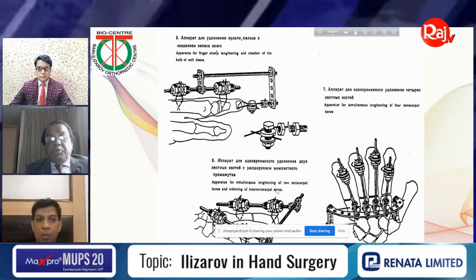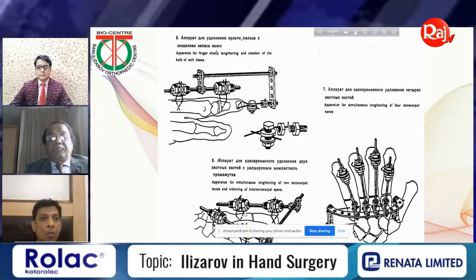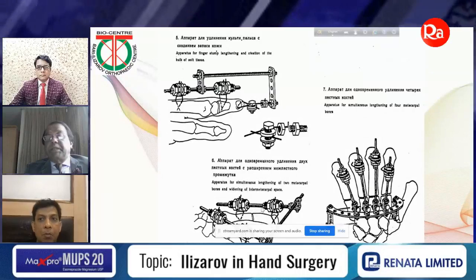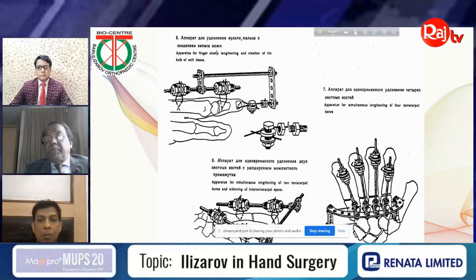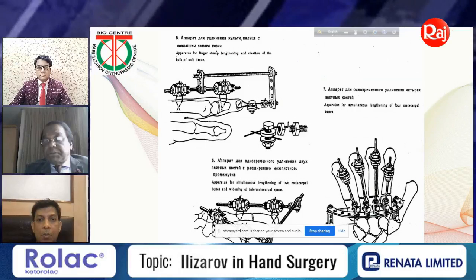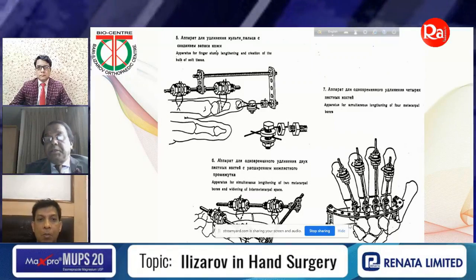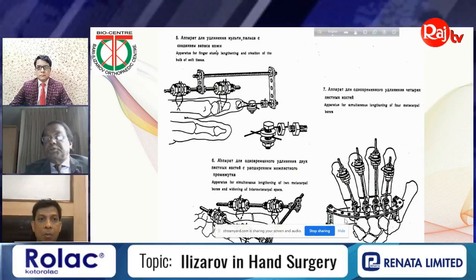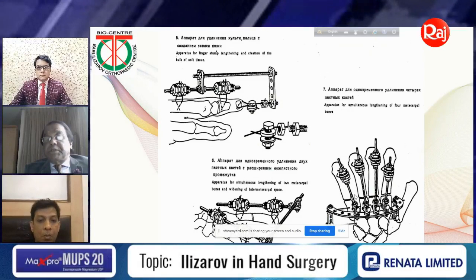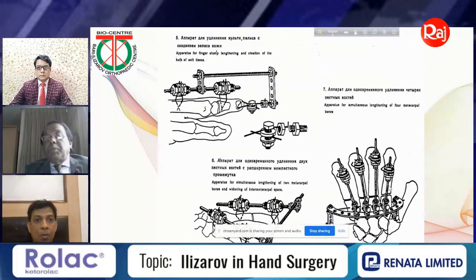Now, dear friend, you can see here, this is the fracture. Think about, you can fix this this way and that way. Very simply, externally, you could do that. If you want to go for lengthening, you can see you just put an arch. This is called bow, small bow, and then here you can fix it with the post, and then mini fixator. These rods are very small, 3 times smaller than the normal rods.